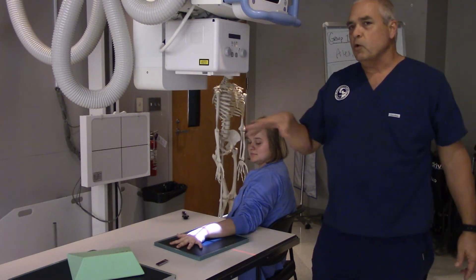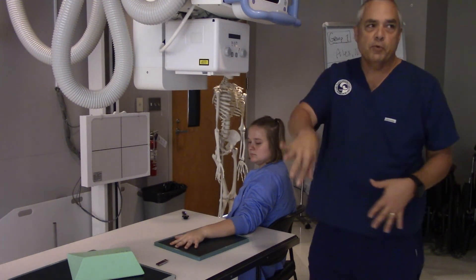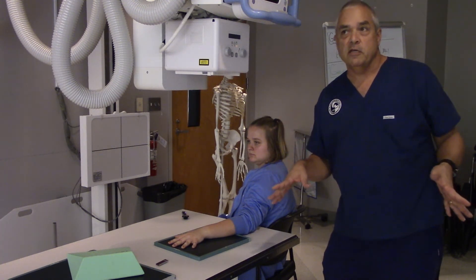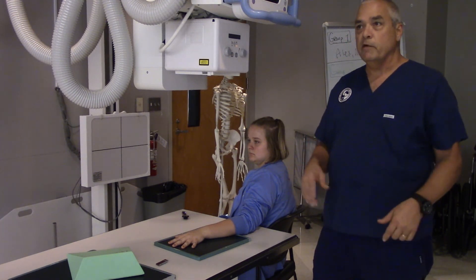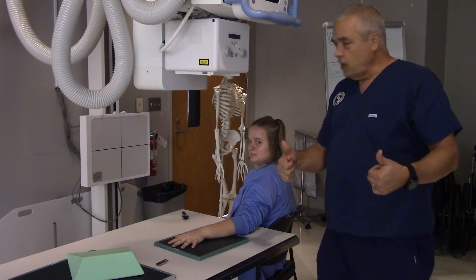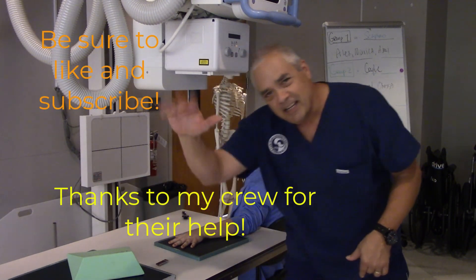Those are four kind of non-standard but definitely useful positions for the wrist — supplemental views. We do a three-view wrist all the time; specific scaphoid shots only if the doctor orders them. For example, you'd have an order that said 'scaphoid with ulnar deviation' or similar. Thank you all very much — that was our quick and dirty supplemental wrist images, and we'll see y'all next time.